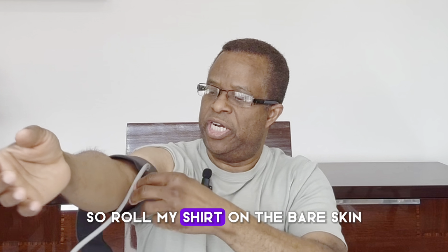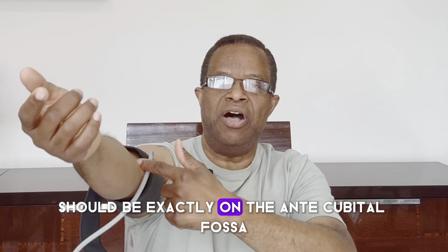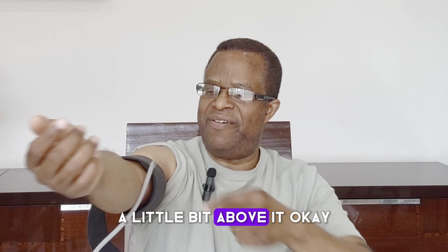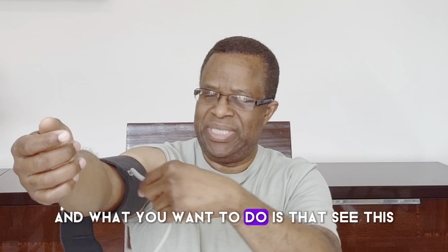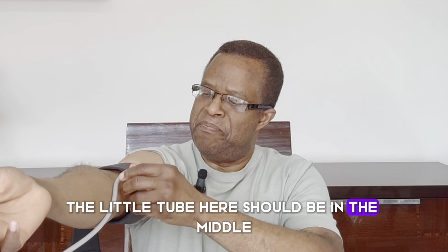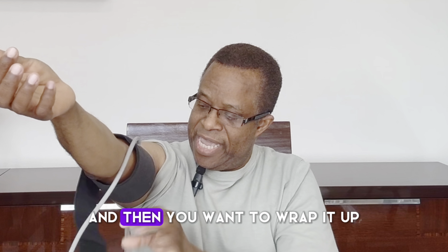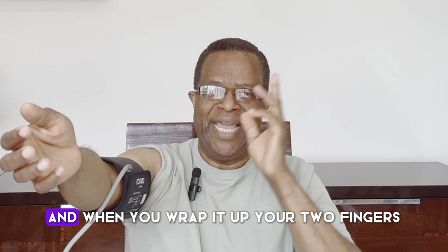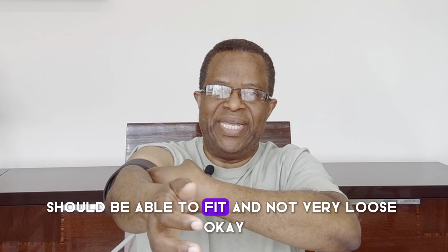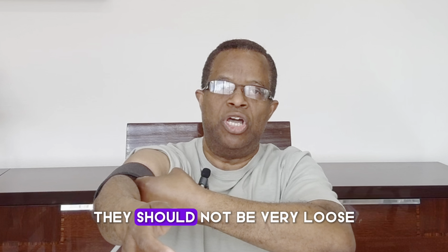So I roll my shirt, put it on the bare skin, and the end of the cuff should be exactly on the antecubital fossa. That means where you bend your elbow, a little bit above it, okay? And what you want to do is, see this, the little tube here should be in the middle, just close to where your vessel is. And then you want to wrap it up. And when you wrap it up, your two fingers should be able to fit in, and it should not be very loose, okay?